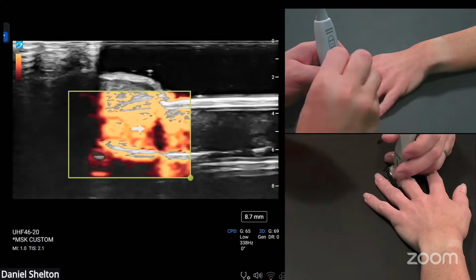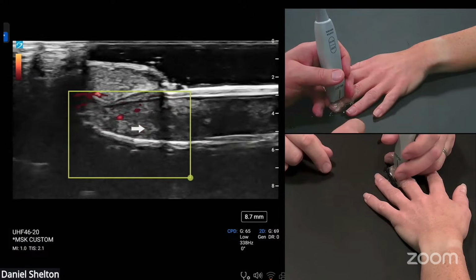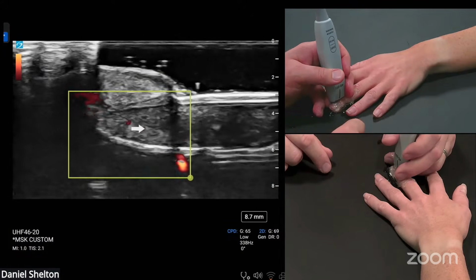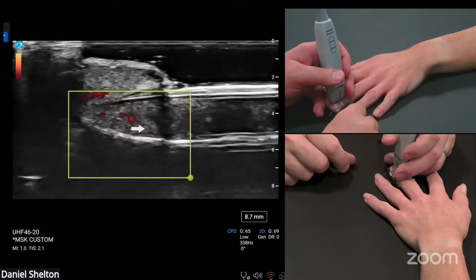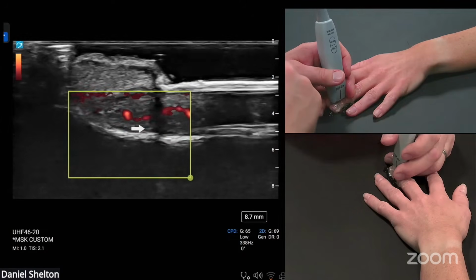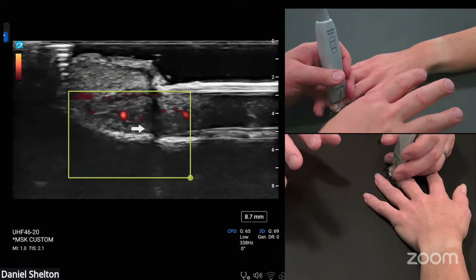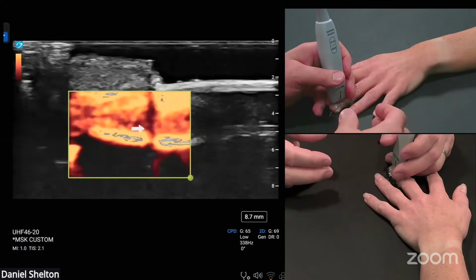So it's taking a flash once every 60th. And if the wheel that's moving on the screen is moving at the same rate as the flash from the shutter of the camera, it'll look like the wheel is standing still. And that's why you see those old films when the wagon is chasing across the prairie and it looks like the wheels are standing still. That's because the revolution of the wheel is catching up to the shutter frame of the camera.